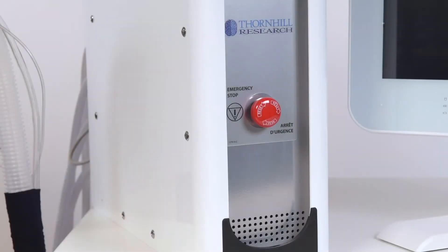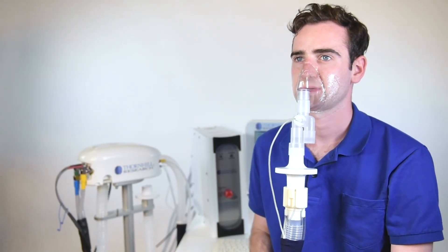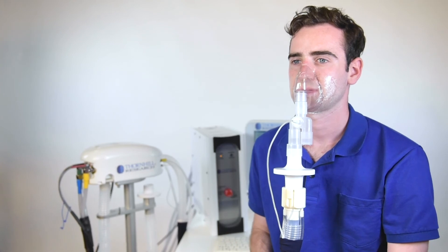If the subject ever becomes distressed and requires the system to stop running in active study, the ResPRAC operator can press the emergency stop button located on the front of the control room unit. Pressing the emergency stop will halt all flow of the compressed gases to the subject, and the subject will immediately begin breathing room air passively via the intake.